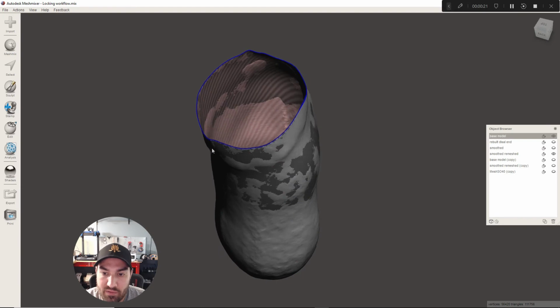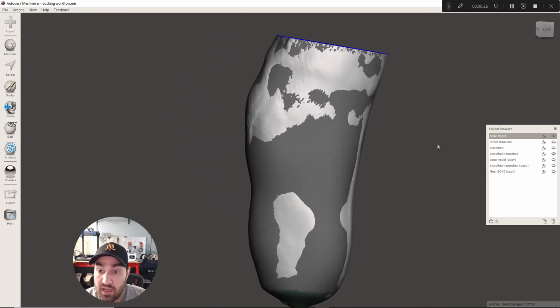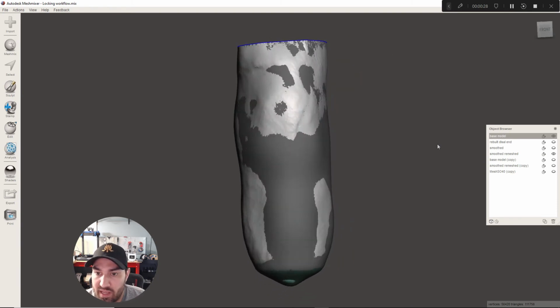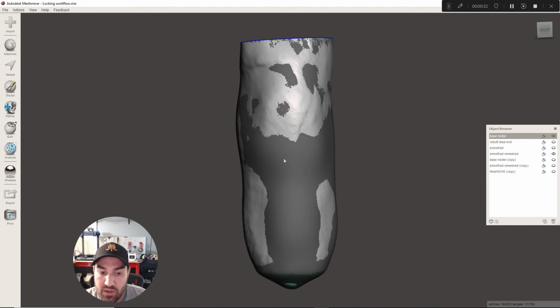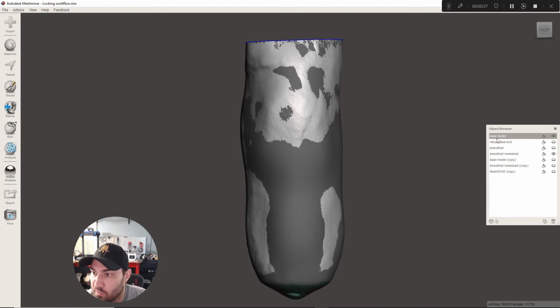So this is why I haven't really done CAD modifications in the past: I didn't know the measurements. So now that we can actually be a little more accurate, maybe it makes more sense to start doing now as a free software where we can measure. So first thing I want to do is show you what we actually changed.